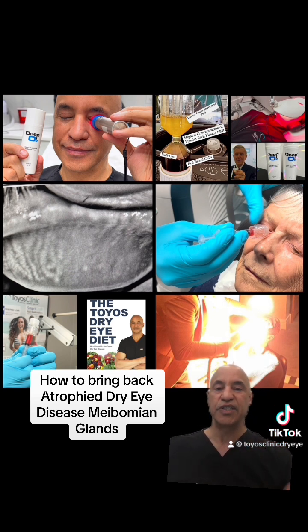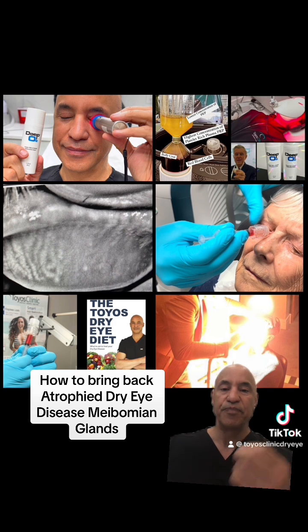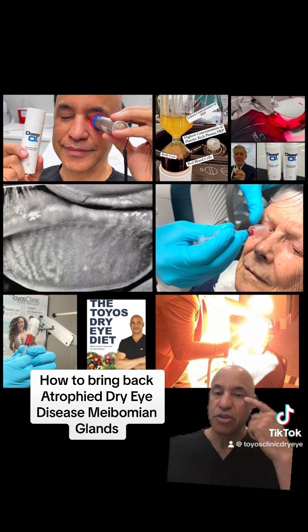Now, say we have stubborn glands where just doing IPL with expression and doing low-level light treatment isn't bringing the glands back. Then I use platelet rich plasma. We can use platelet rich plasma drops — usually I'll use the drops to rejuvenate the cornea and bring back nerves — but we can also use platelet rich plasma to bring back the meibomian glands. In PRP, not only do we have nerve growth factor, but we have insulin-like growth factor, which is great for bringing cells back. So what we do is inject PRP into the meibomian glands.